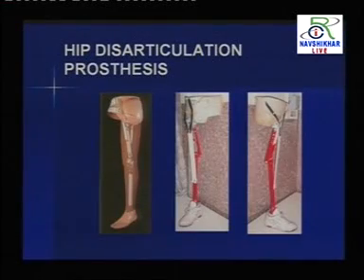After that we got some components which are modular components. We can see in this slide, these are the components, one is covered with the foam cover, and inside that you can see the tubing, aluminum tube with the joints itself. And there's another red color, you can see the indigenous joint that we have made in our own country, local joints with our local material to just reduce the cost.